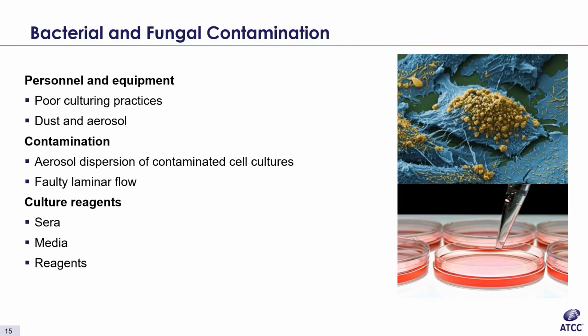Improperly maintained equipment can prevent protection from the entry of contaminants. Overpacking autoclaves or ovens can even cause problems with uneven heating, creating pockets of non-sterile supplies. The flow rate of hoods, if not properly adjusted, can allow particulates to enter.